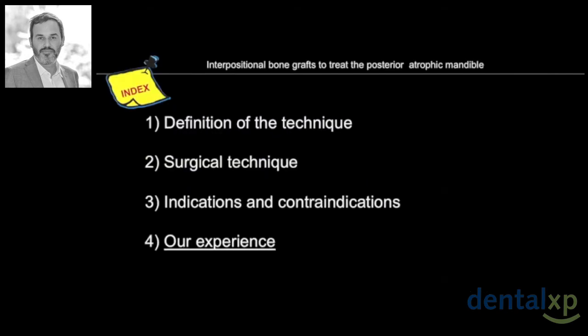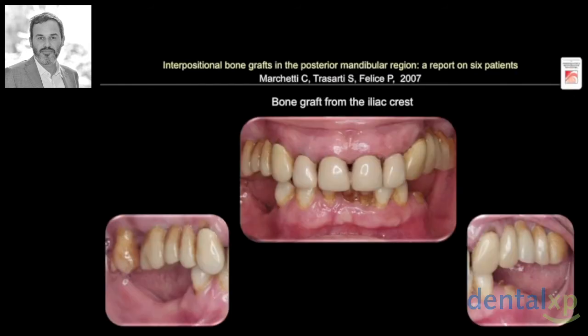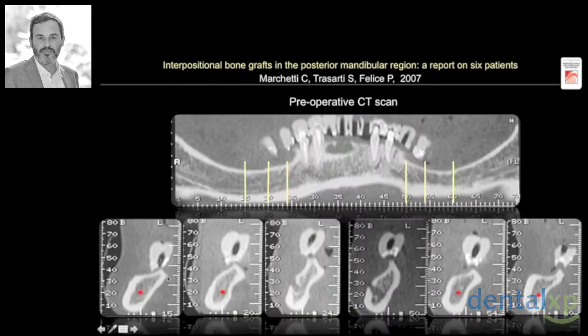I have performed the inlay technique for more than 10 years, and we started with autologous bone grafts, in particular iliac crest bone block. And this slide shows the first patient we treated with the inlay procedure back in the 1990s. I was still a student. And note the clinical lack of the bone in the posterior mandible. And this is confirmed by the CT scan.